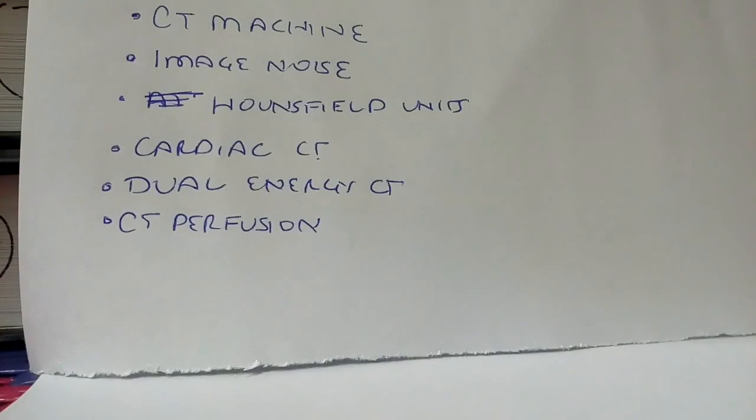And what is the method of image formation? The method of image formation is called filtered back projection, in which the raw data is acquired and then it is thrown back onto the anatomically relevant image, and image reconstruction is done. There's a lot of physics to it, and we will not go into so much detail.